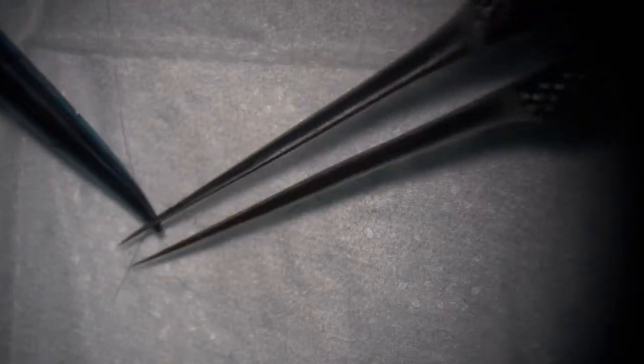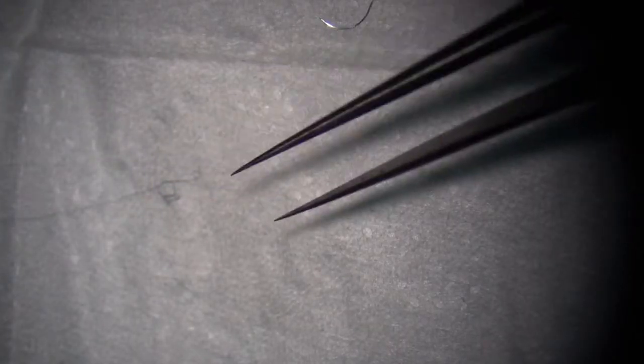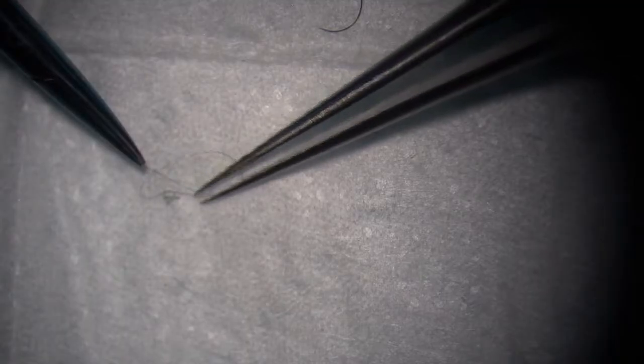Yeah, and then tie knots. First knot we make a surgeon's knot. And then you switch hands when you tie it, so you're not crossing your instruments. Is that correct? Yeah, that's why we pass the suture, so we can avoid having to cross the instrument. If we didn't pass the suture to tie a square knot this time, we didn't cross our instrument, we keep pulling it, it will become a slip knot, and then we have to cross the instrument. Oh, and you want to avoid that, of course. Yeah, so that's the point of passing the suture.